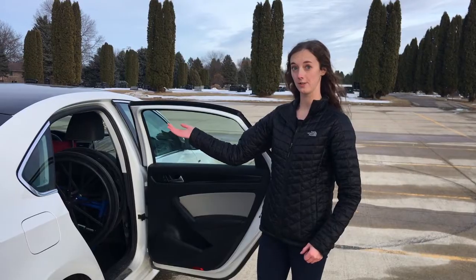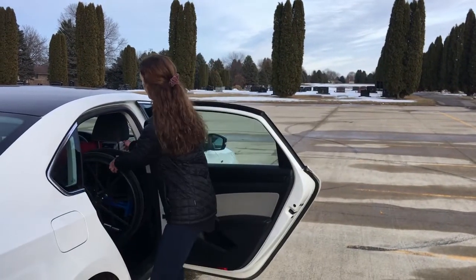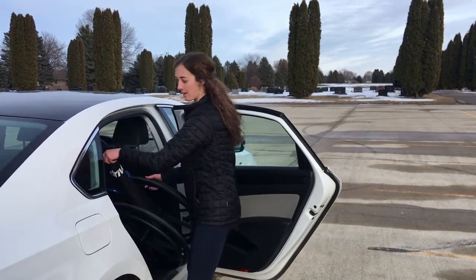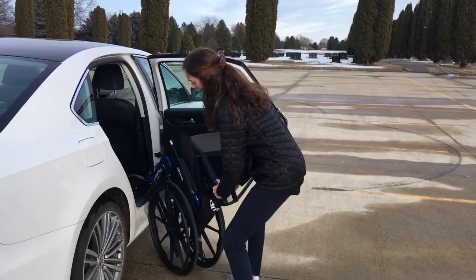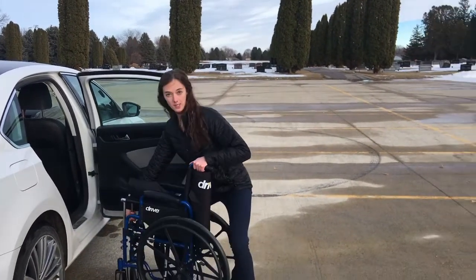Now I'll show you how to unload the wheelchair, which is basically just the reverse of how you load it in. All you need to do is grab the back wheels and tilt it at an angle so you don't hit the top of your car. You can also grab onto the handle and tilt it all the way back until it's touching the ground.